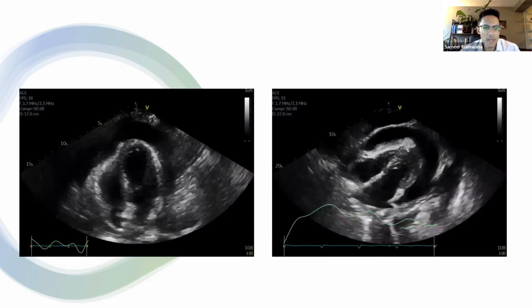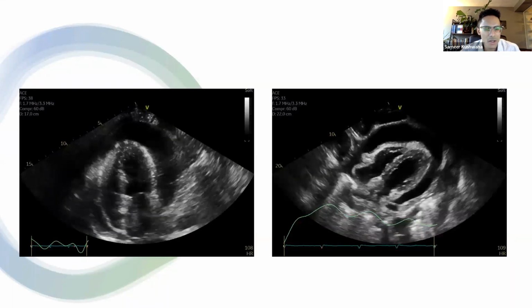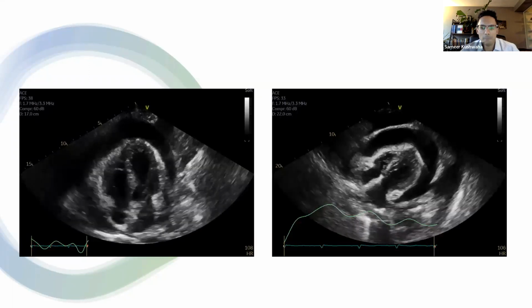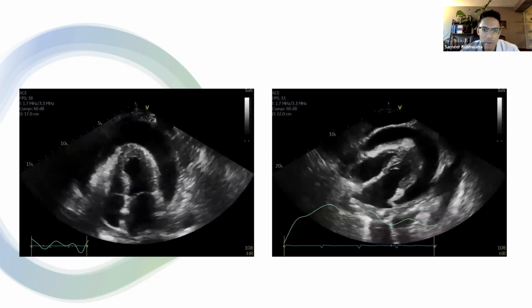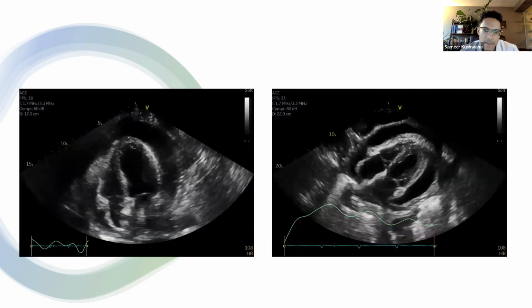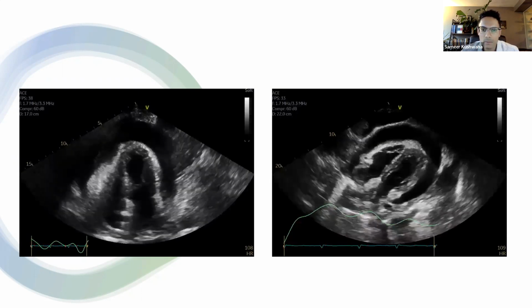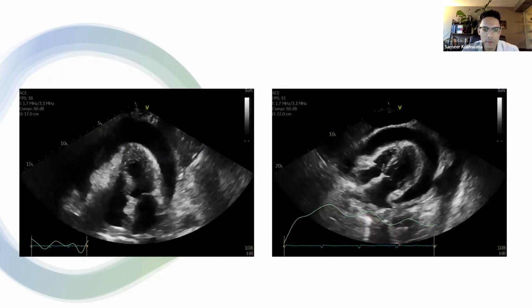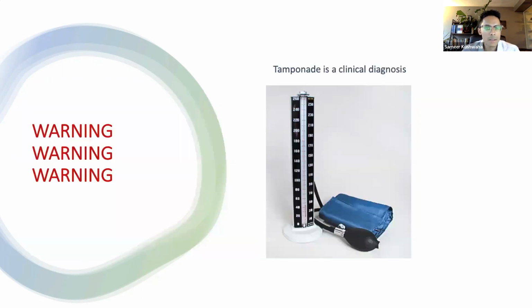So on the left, there's an apical 4-chamber shot with a large pericardial effusion. It measured out to about 2.5 to 3 centimeters at its largest. As mentioned, looks like there is probably some chamber collapse of the right atrium and the right ventricle. And you can certainly see a bit of a swinging motion. So all this is concerning for the development of tamponade. And you can also see that the patient is a little bit tachycardic.